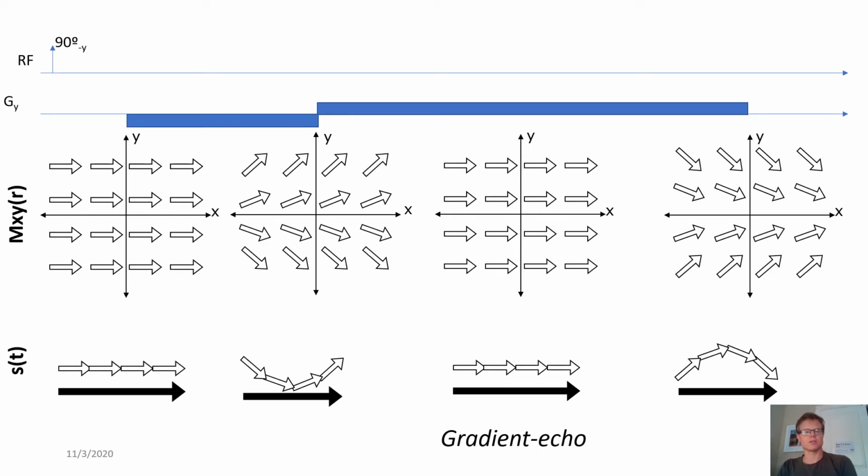Now, there's this concept we've mentioned called the gradient echo, and I think this is very clearly shown in this type of illustration. Okay, where if we look at a time before a gradient, and look at these 4 times here.